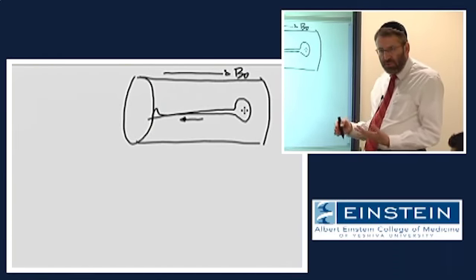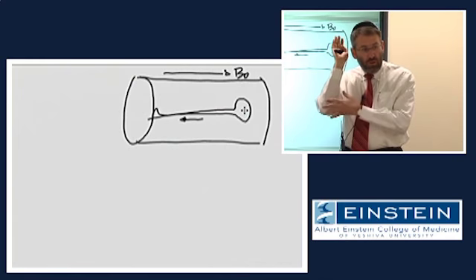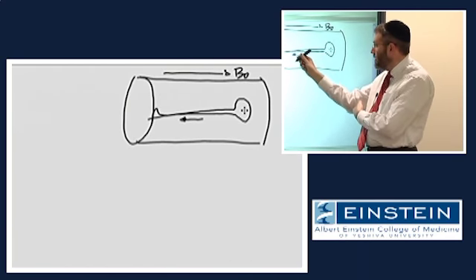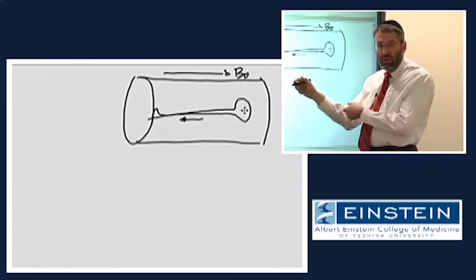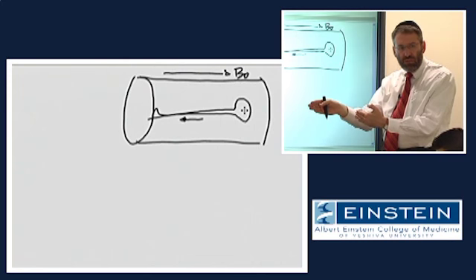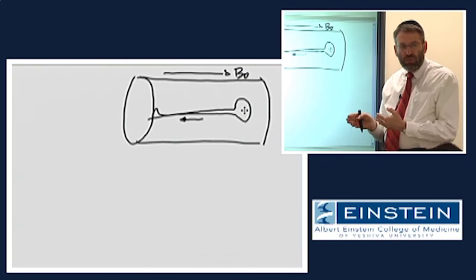And then we go through this procedure where we turn on our B1, our RF, tilt this magnetization into the transverse plane, and listen for that signal at some point that we choose, called TE, as the signal is relaxing or going away.